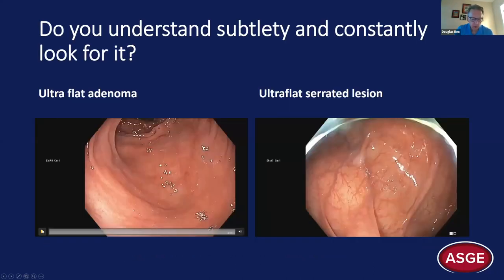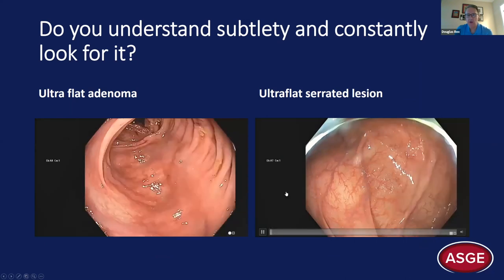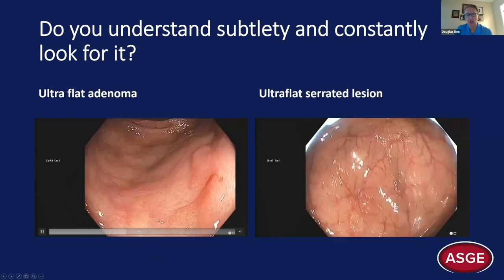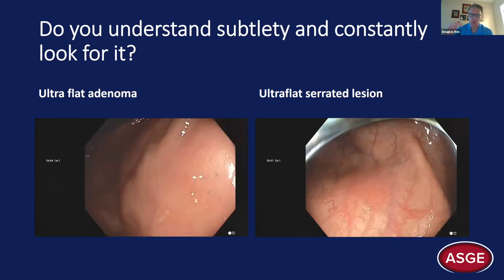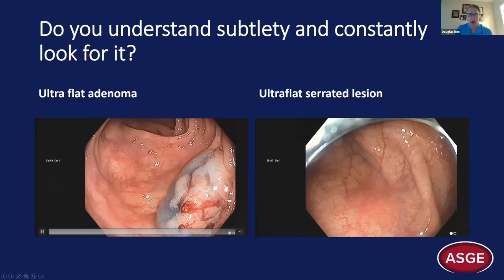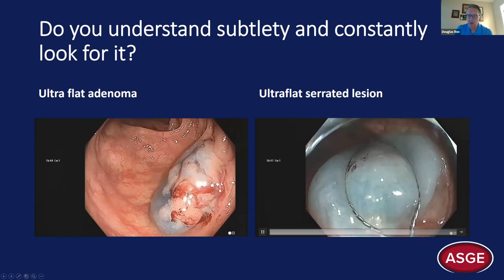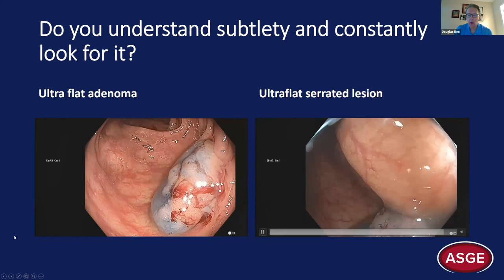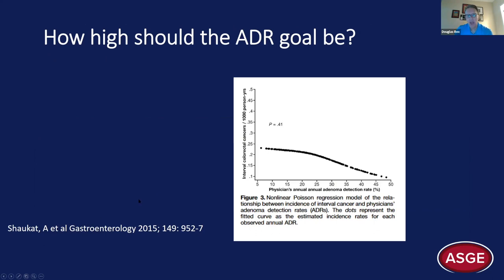On the left is a very flat conventional adenoma and on the right a very flat serrated lesion. To detect these you have to approach the procedure with a sense that you're looking for very subtle changes in color, texture of the mucosa, disruption of the vascular pattern, and shape. The adenoma on the left appears better after injection. The flat serrated lesion on the right is probably Paris class 2b — truly flat. Most truly flat lesions I've seen in the colon are serrated lesions.